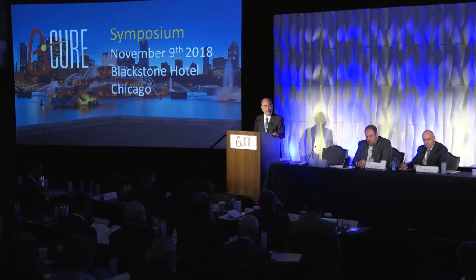And my question for you is, with regard to your experiment, you have the smart pump, which is regulating RPMs. How did you, in the control arm, set the RPMs with a fixed speed? That links with the question, which is, let's say clinically, wouldn't I want to just run the RPMs as high as possible so that I don't get suction or arrhythmias, and just leave it at the maximal speed? How would the smart pump have an advantage over just setting the RPMs at the highest possible value that I could?